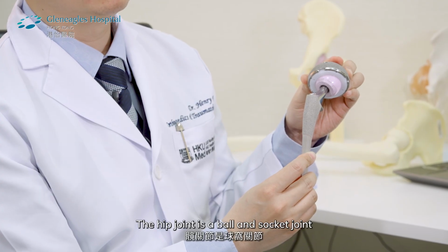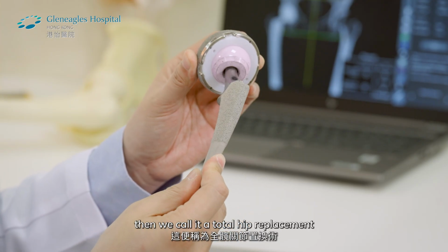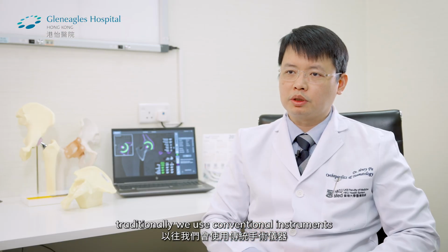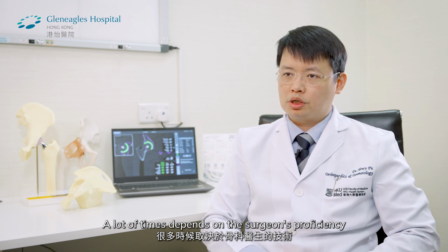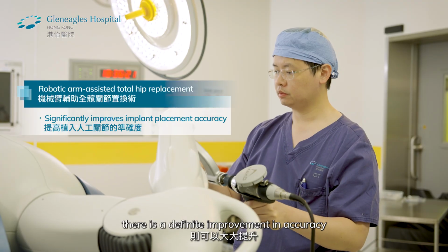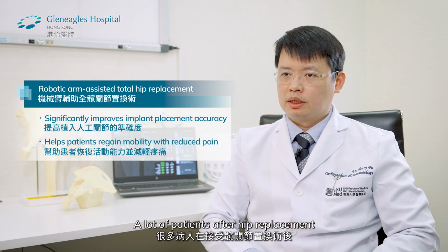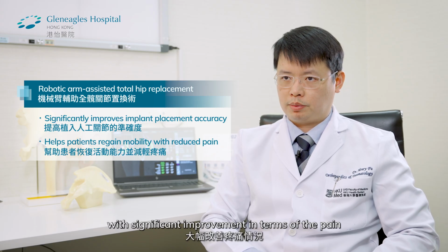The hip joint is a ball and socket joint. We replace both the socket side and the ball part, then we call it a total hip replacement. The way we perform total hip replacement, traditionally we use conventional instruments. A lot of times it depends on the surgeon's proficiency as well as the intraoperative decision. With robotic-assisted surgery, there is a definite improvement in accuracy in terms of the implant placement. A lot of patients after hip replacement would regain their mobility with significant improvement in terms of the pain.